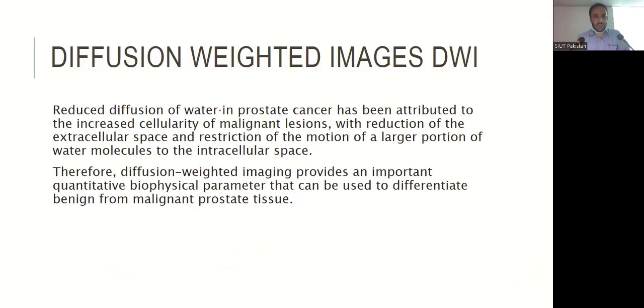Now we come to the diffusion weighted images. Reduced diffusion of water in prostate cancer has been attributed to the increased cellularity of malignant lesions, with reduction of the extracellular space and restriction of the motion of a larger portion of water molecules into the intracellular space. Therefore, diffusion weighted imaging provides an important quantitative biophysical parameter that can be used to differentiate benign from malignant prostate tissue.